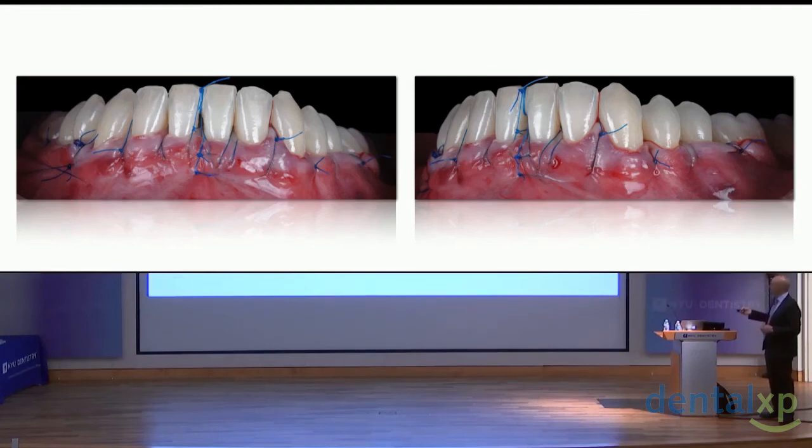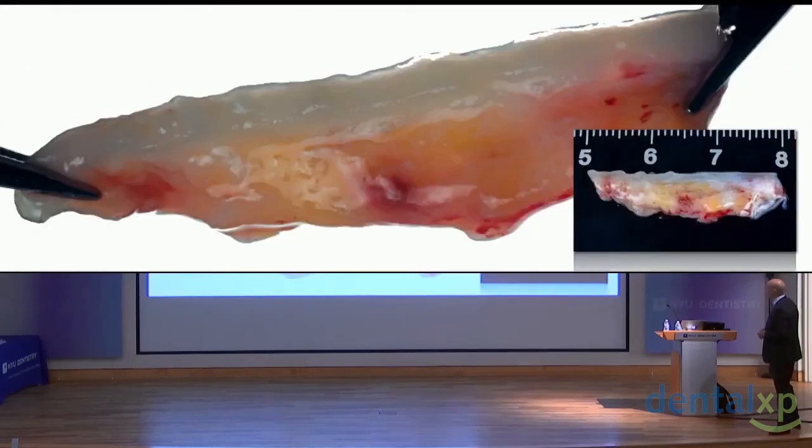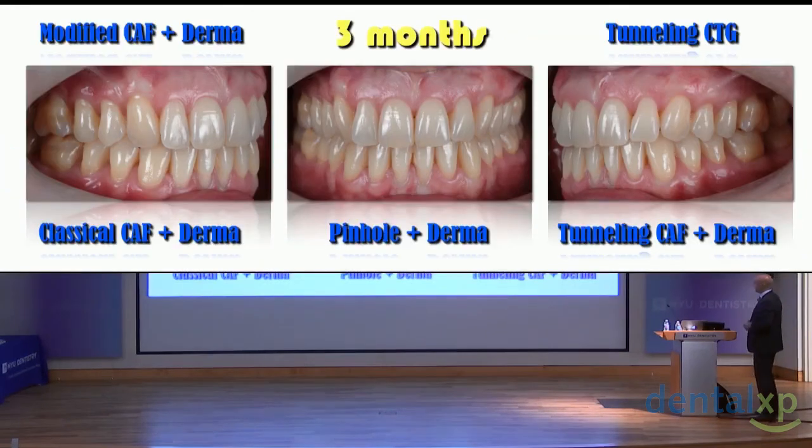Everything seems okay in the beginning. And only on this side, I used Bruno's technique, very quickly, very simple. Let's look at the results. Let's compare the results. The best situation, the connective tissue graft, by far.